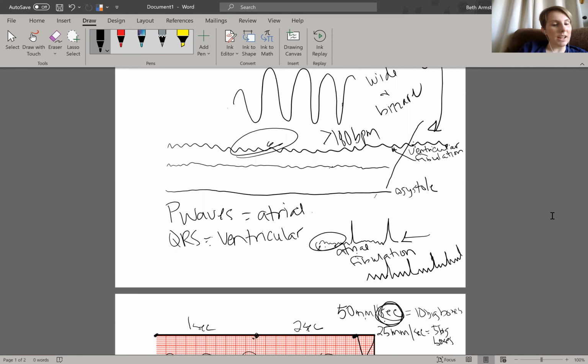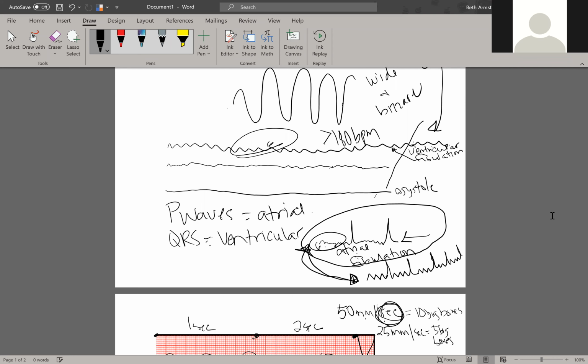So Amanda, you said atrial fib. So atrial fib is this one right here. These two get confused all the time. Is it ventricular tachycardia? Nope. So is it atrial? Let's start there. Is it atrial or ventricular? Oh, duh. It's atrial.